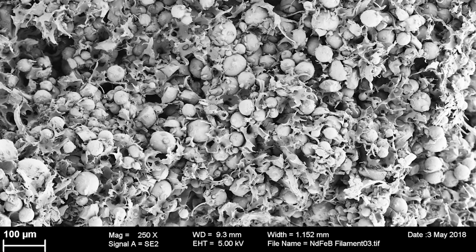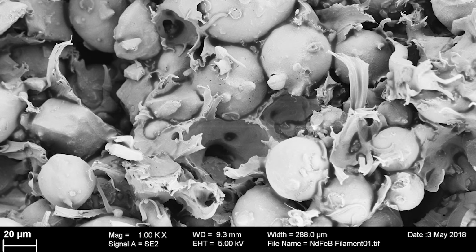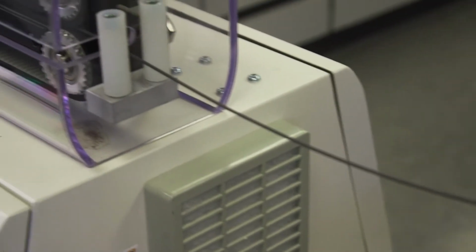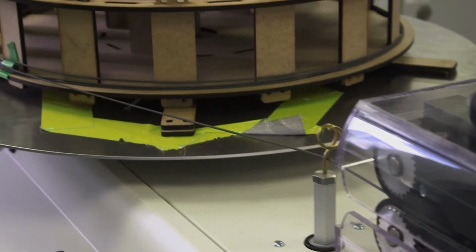Our final composition has a loading of 92%, which corresponds to a very dense packing of the magnetic spheres and the polymer in between. We reach remanences of 600 millitesla, which is about twice the strength of ferrite magnets and half of neodymium iron boron magnets commonly used in rotary blood pumps.